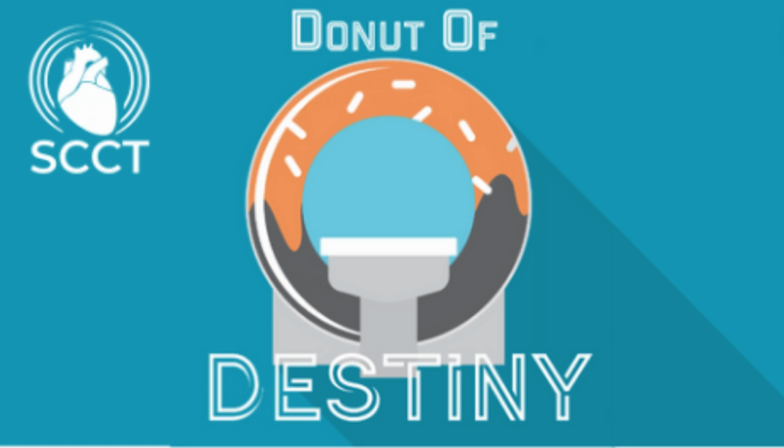So if volumes are growing so much, I think there is an incentive to use systolic imaging and get rid of all the medication challenges and inefficient workflows, so that we can increase the throughput and serve our population that needs to be served with this technology.